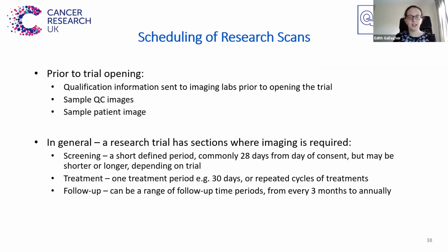But if the imaging is a key part of the trial question and outcomes, a much more extensive qualification procedure may occur. This could include a visit to the site, sample QC information and images, sample patient images being sent for independent analysis by the imaging lab. I did have a trial whose qualification of the camera required a total of 2.5 days worth of imaging, which was extremely difficult to schedule around a full-time working department.